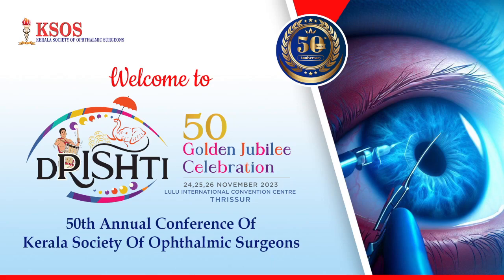You can also give steroids, but there are studies which have shown that 4 milligram IVTA has a lot of post-operative complications. Instead you can give 1 milligram IVTA, which has very minimal complications. With cataract surgery, doctors are preferring anti-VEGF, but IVTA can be given in such cases, and it will definitely improve patients who have these good prognostic factors. In poor prognostic factors, even IVTA might not work very well. On OCT, if there are a lot of hyperreflective foci, these indicate inflammation. In these cases you can consider steroid injections; they'll be more useful than anti-VEGF.